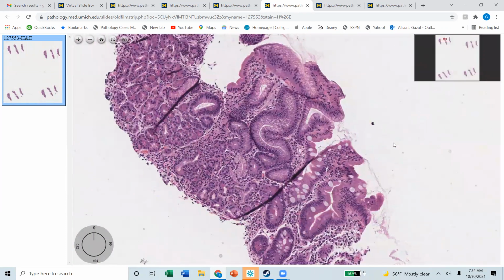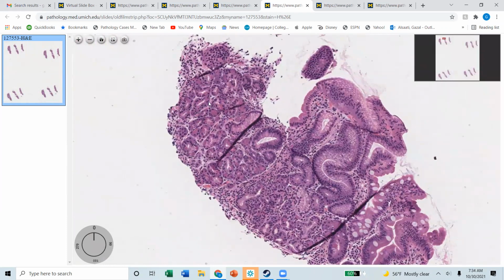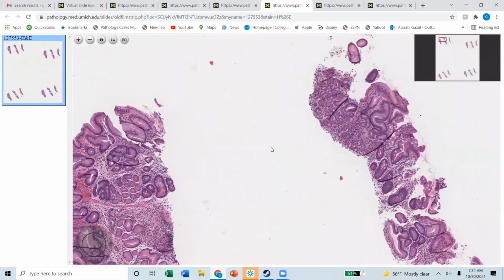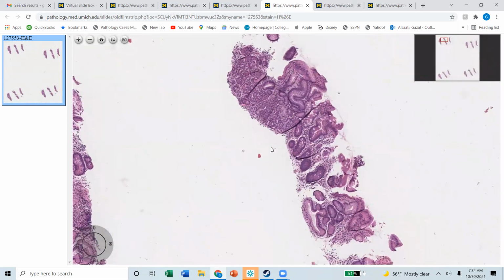And then also, oops, here is pancreatic metaplasia. See that? Can I ask one more question in between? Yeah. Sorry. So you said it's antralized, right? So it should be looking like a gastric antral mucosa or intestinal metaplasia, or how?